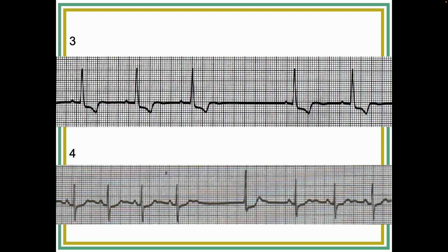And then it's an escape beat. What is the escape beat? I think it's an escape beat right here where there's that giant pause. Okay. Now, what's another possibility of what it could be? Sinus block. I heard the correct murmur over here. Yeah, it could also be a sinus block.